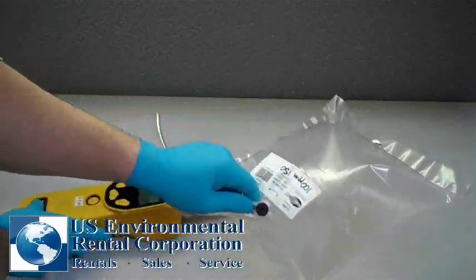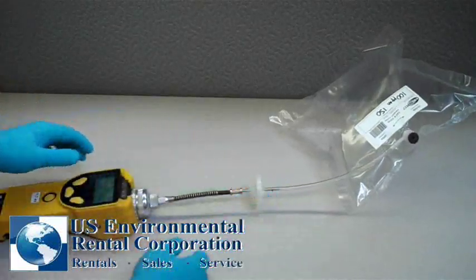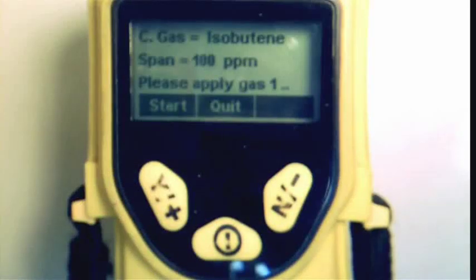Now, open the valve on your Tedlar bag and make a secure connection to the probe tip. Once the unit detects gas, it will begin calibrating automatically.